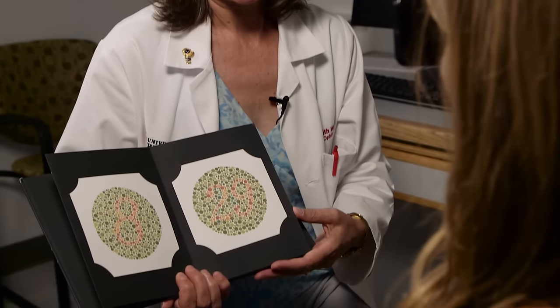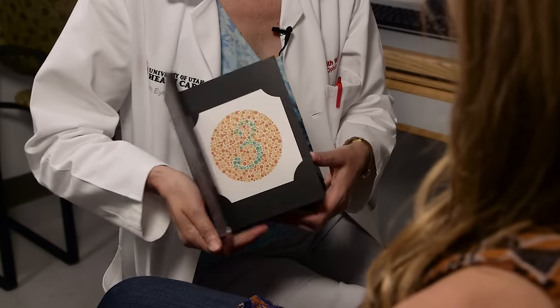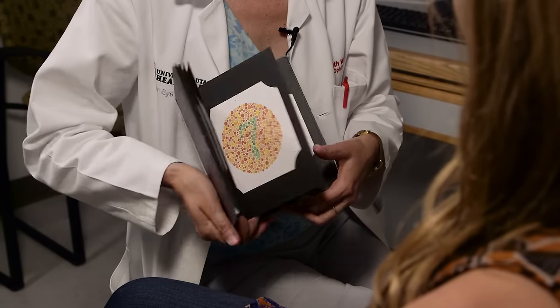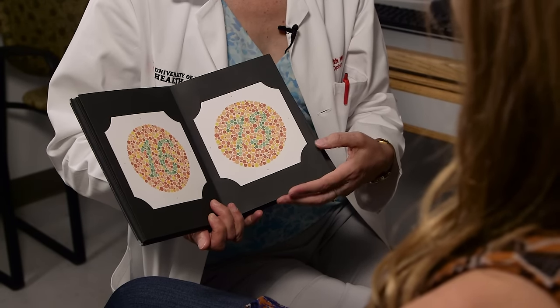12, 8, 29, 5, 3, 15, 74, 6, 45, 5, 7, 16, 73. Those are the plates we use routinely for checking optic nerve dysfunction. It's important that the technician notes whether the patient can see the control plate. If somebody with really good vision can't see the control plate, that may tell us something. Also, a patient may struggle in one eye and do well in the other, and that needs to be documented. This set of plates can also be used for checking the type of color vision deficit, such as protan or deutan.